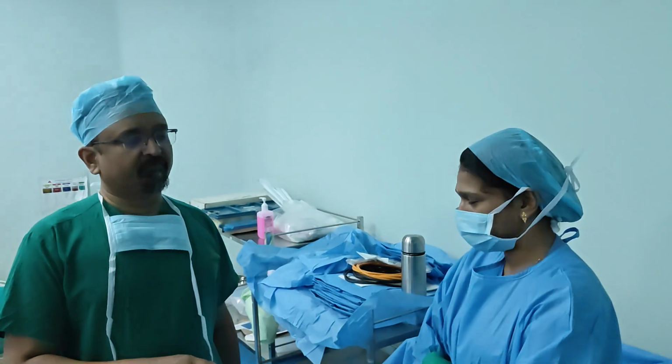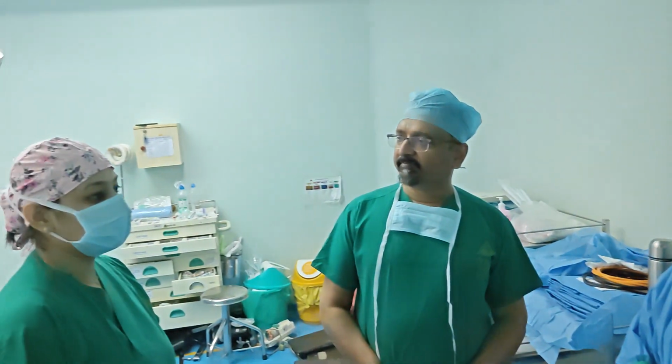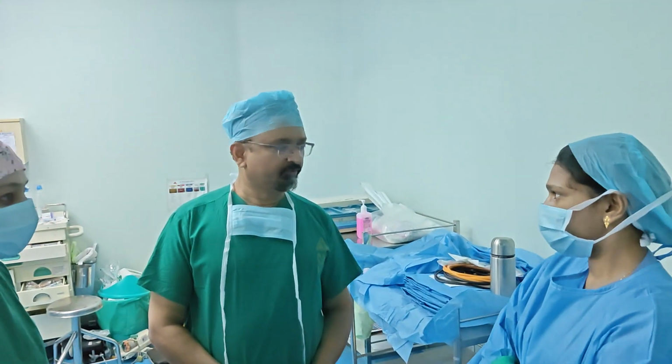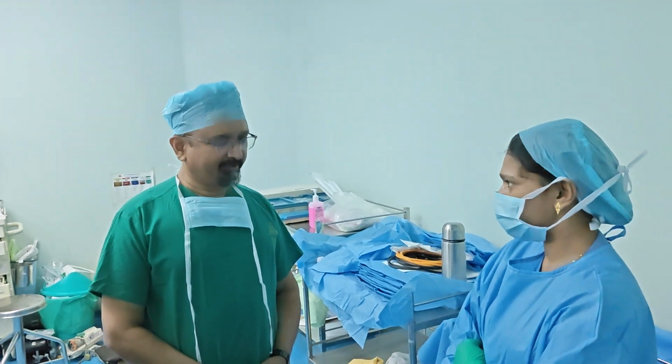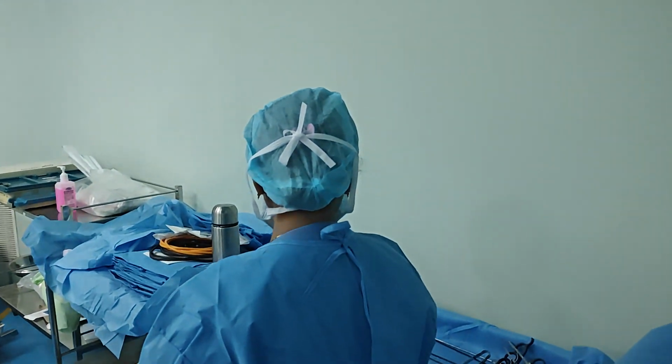Now, in this patient, what is the size of the stent which is needed? Since it's an infant, 2 months old, we would require 3 French and 10 centimeter. Do we have both today? Yes, we have both today. Then what are the instruments we have? Can you please show what instruments we have?